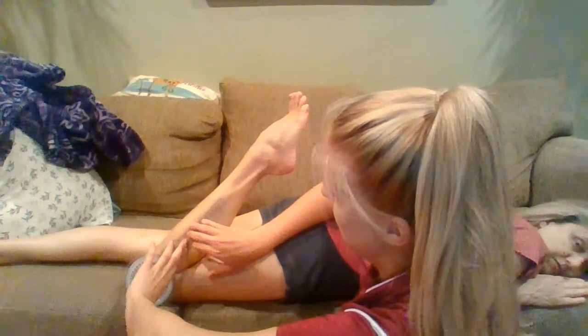I am going to be putting the immovable hand in line with her femur, lining up with the greater trochanter of her femur, and I'm going to be putting the movable hand in line with her lateral malleolus, so in line with this malleolus right here. And once again, I'm going to ask her to slowly flex her knee, and that movable hand is just going to go along with it. So go ahead and flex your knee slowly and just bring your heel to your butt as far as you can. Good. All right. She's reached her end point, so I'm going to pull that away.